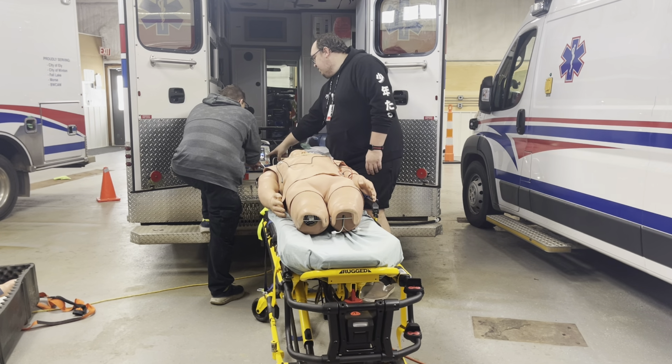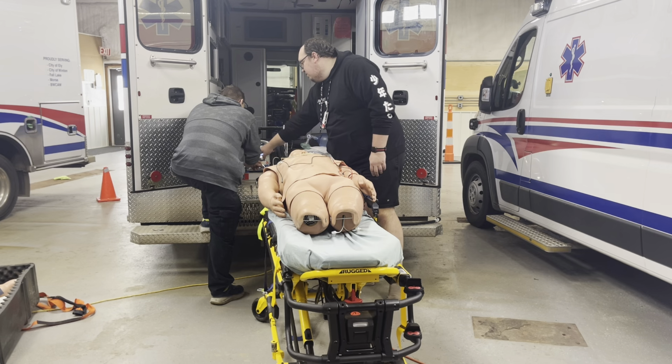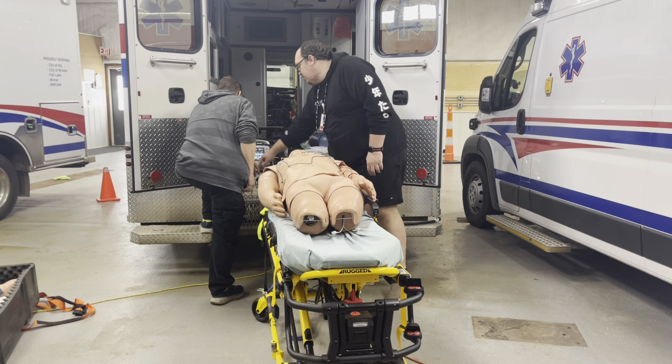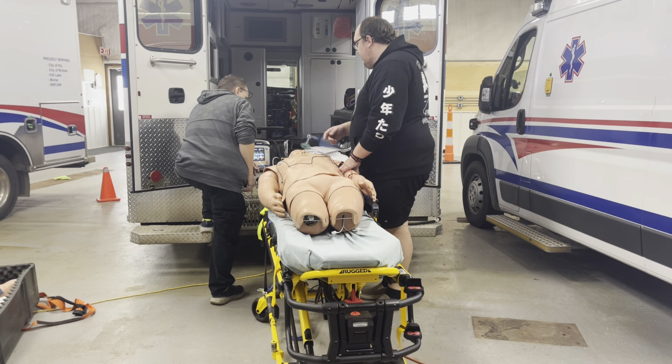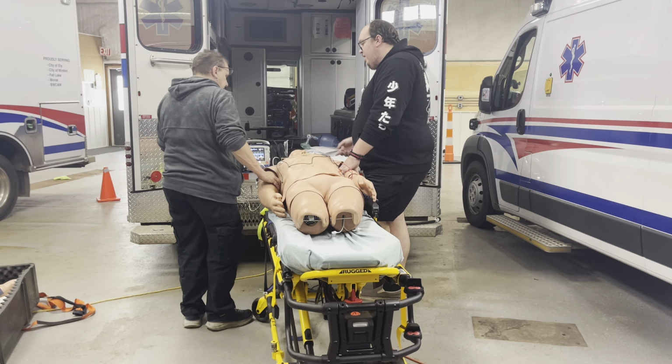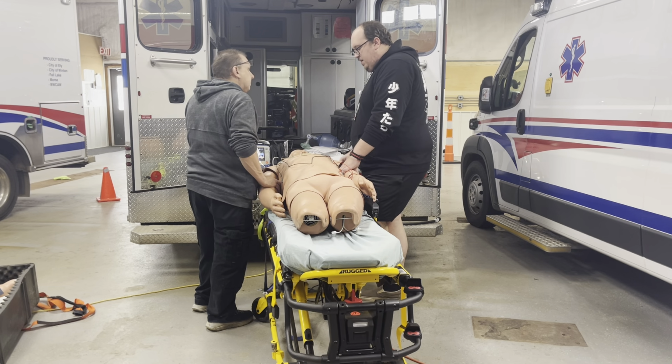And then to confirm it, I just go back out of here. And if you go all the way down to here, this will show you what it's doing. And then to get back into there, you just hit pacer. So you're pacing him, you're talking to him more, you're getting some more information. He's got congestive heart failure. He's got an extensive cardiac history.